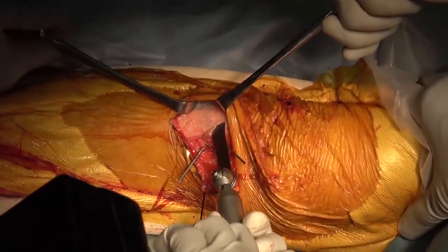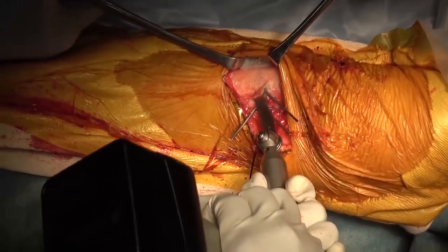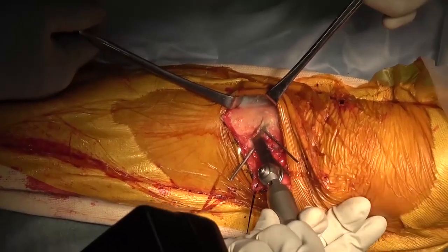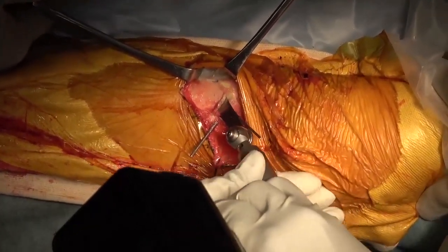Then, using a long micro-bone saw of 40 mm length, an oblique ascending osteotomy is performed along the 2 guide wires. The distal end of the tibial tuberosity bone is cut in a proximal medial to distal lateral direction.